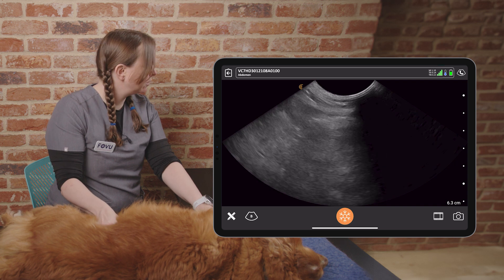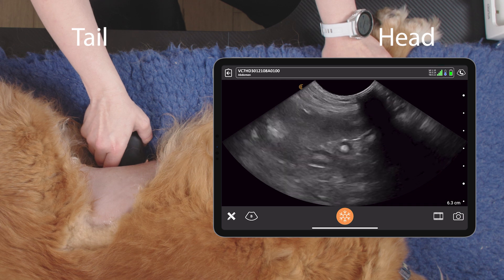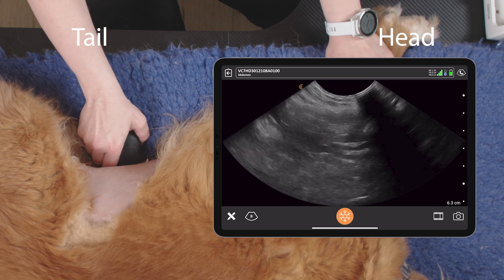And our final view is our spleno-intestinal view, where we look underneath the dog at about the level of the umbilicus, where we can find spleen and intestines. And we again fan and rock.